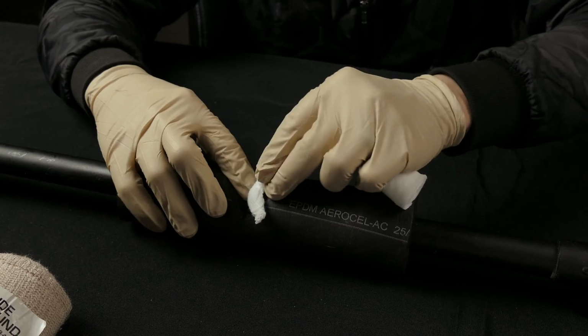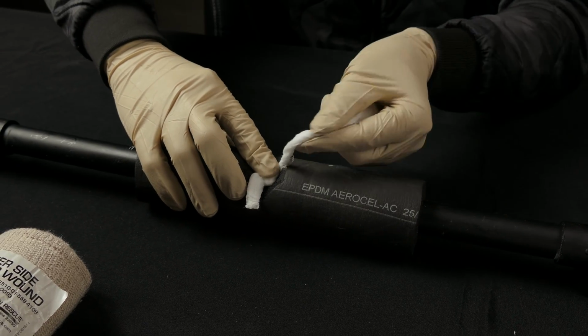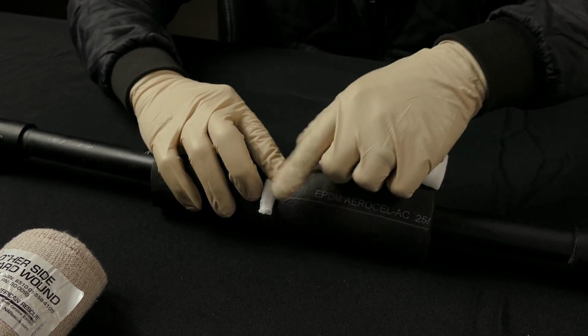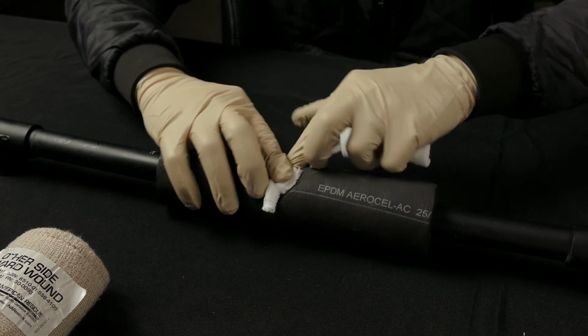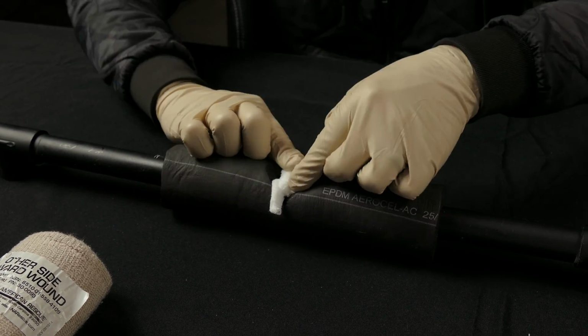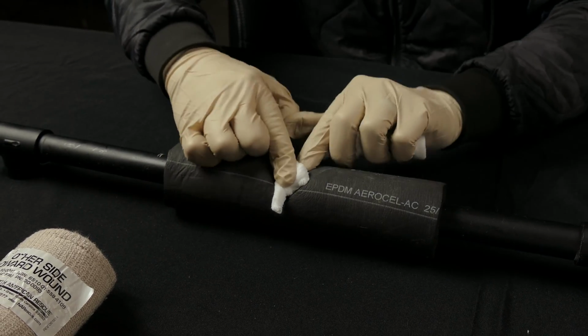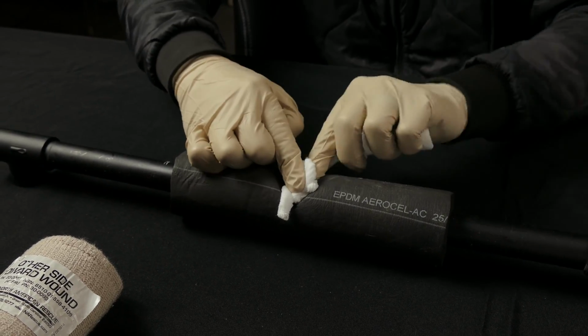So I'm gonna take this knot, I'm gonna slide it down on top of my other finger till I get close to the point, pick my right finger up, and then put pressure back down on it. Now just finger over finger, I'm gonna grab here, I'm gonna push it down in the wound, hold that pressure, and I'm just gonna start filling this entire wound with gauze.